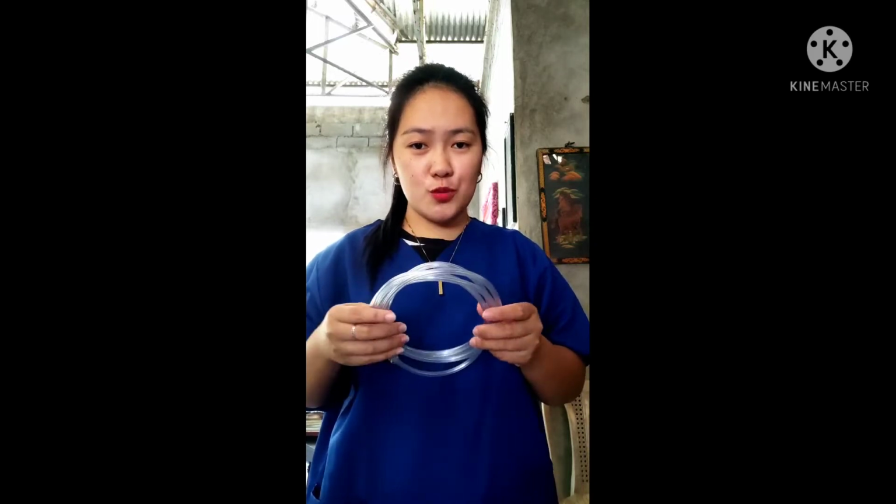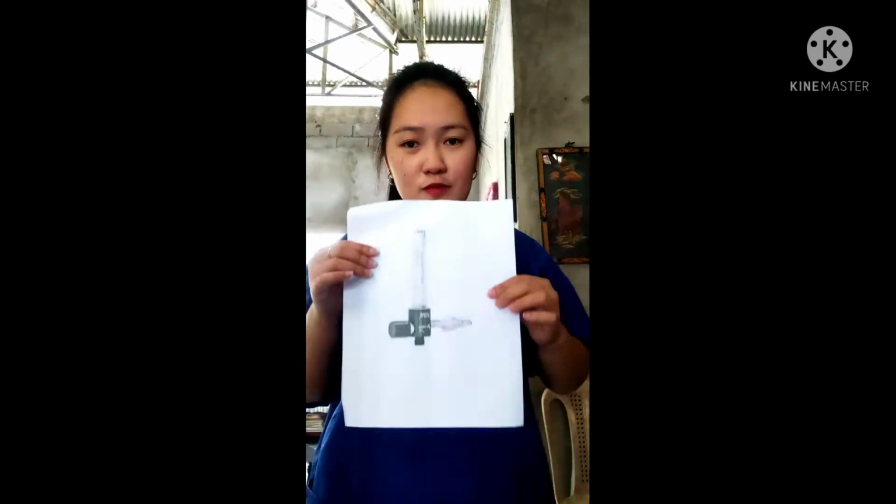These are the equipment that we need. Client's chart and cardex. Oxygen connecting tube. Let's assume that this is an oxygen connecting tube. Flow meter. Let's assume that this is a flow meter. Humidifier filled with sterile water. Let's assume again that this is a humidifier filled with sterile water.